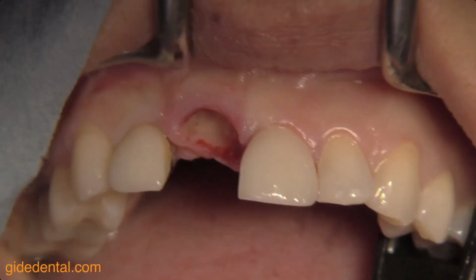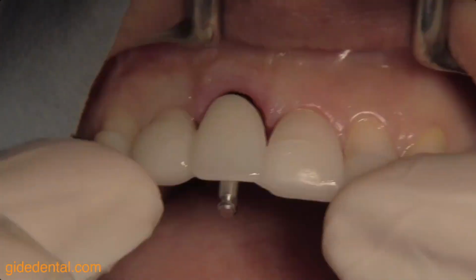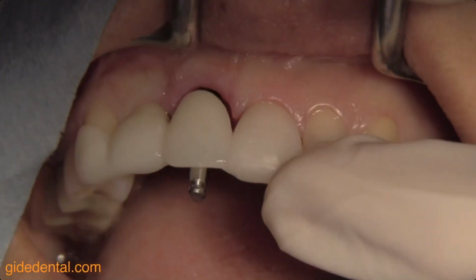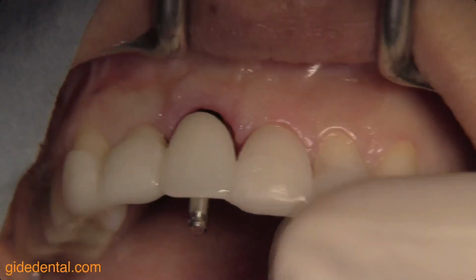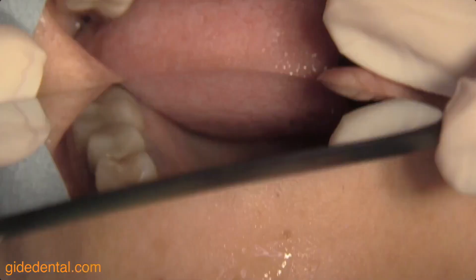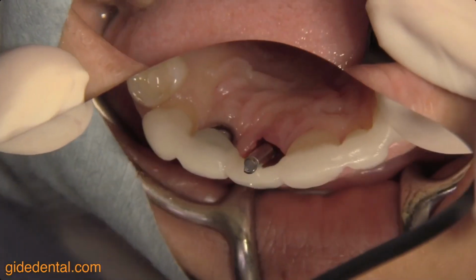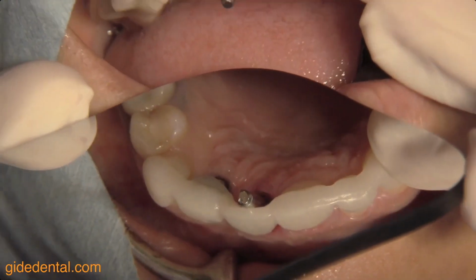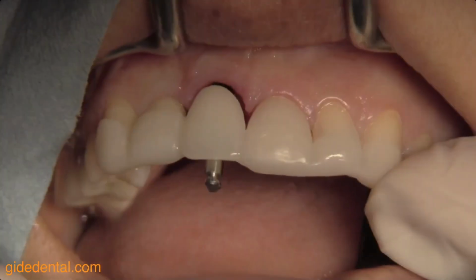And at all times I'm placing the drill back and I'm checking it with the surgical guide. So this is just my own personal quality control that I maintain that palatal position of the drill. And I'm still in a good position, as you can see here. I'm palatal through the site of this incisor ledge. So this looks really good.